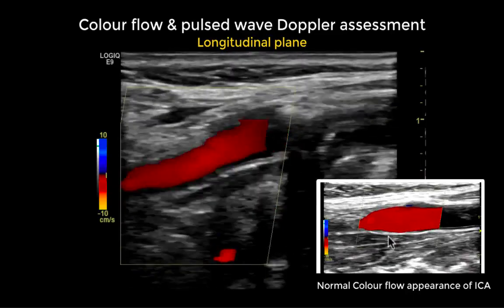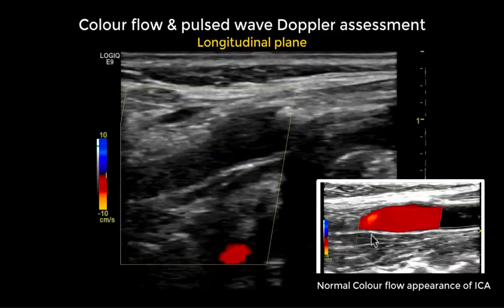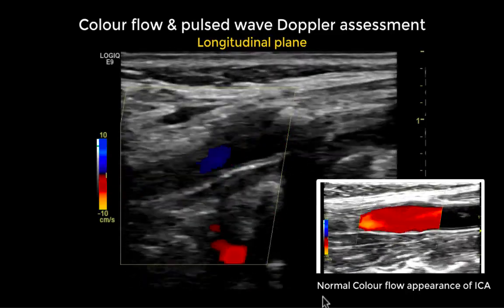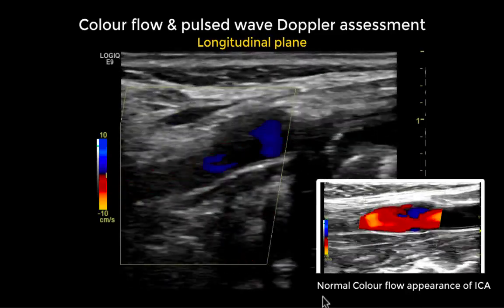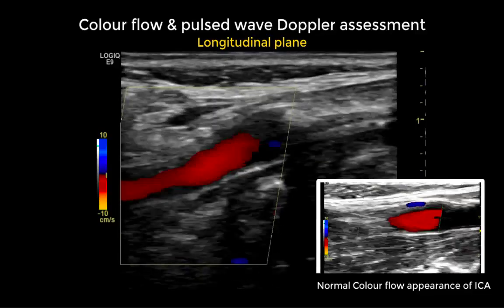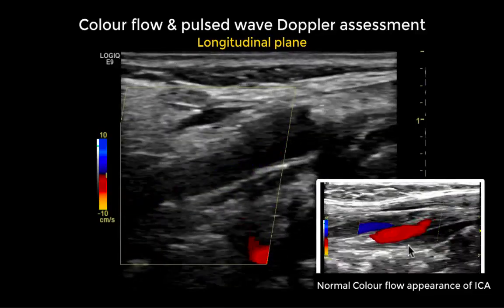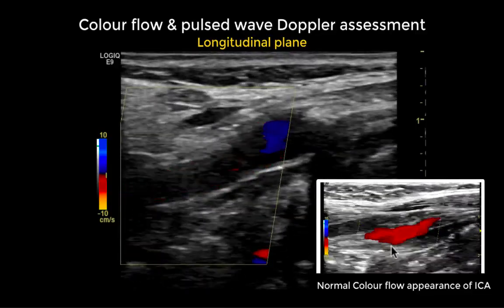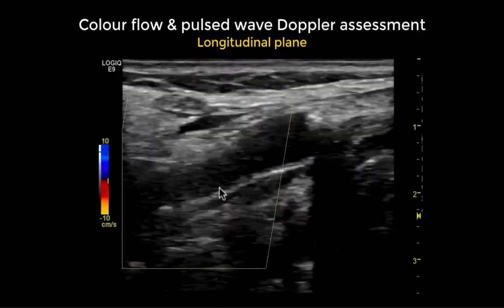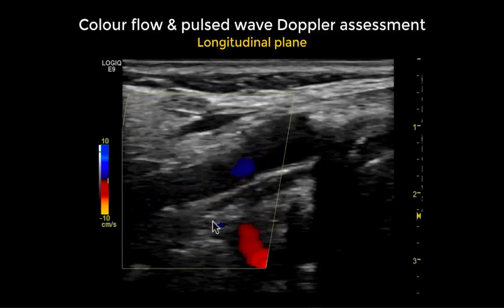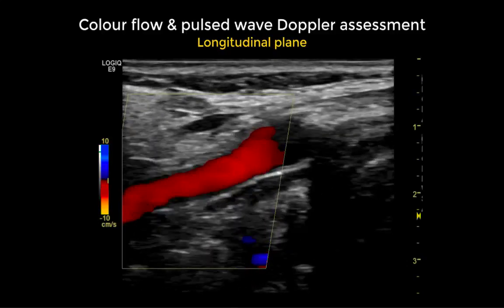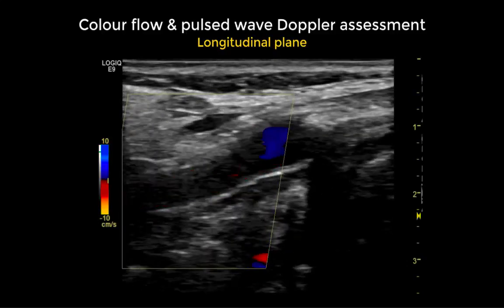In normal conditions there is continuous filling of the internal carotid artery. You can see here the difference between a normal pattern of colour flow and the abnormal alternating pattern we are observing.